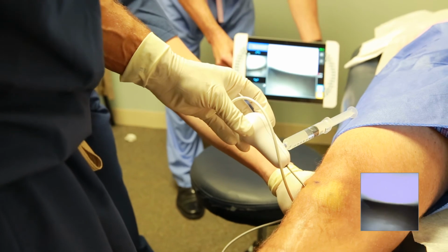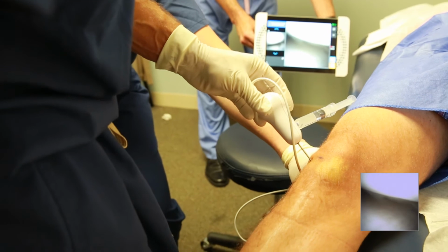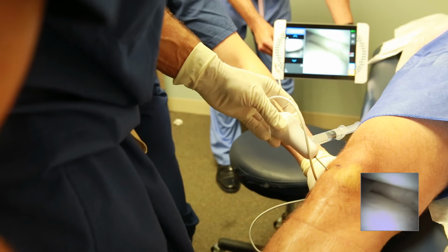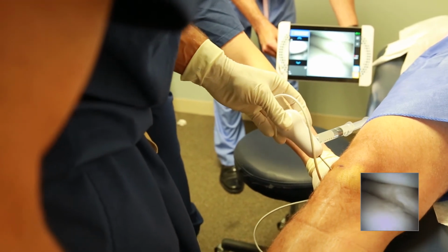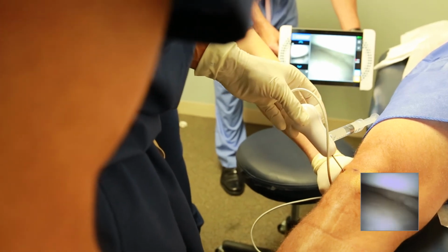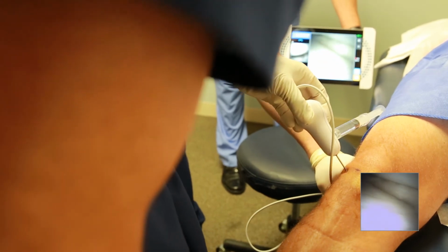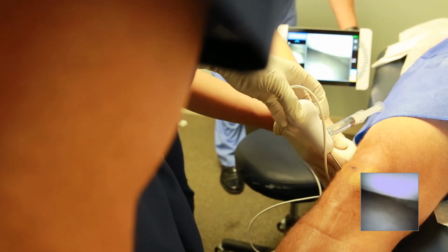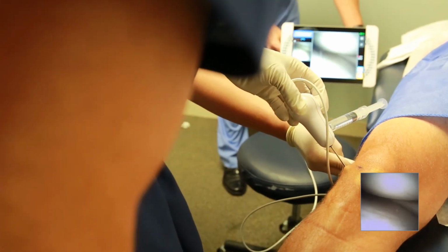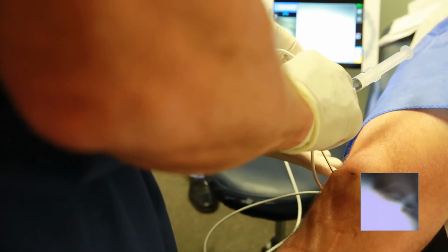Lift that up. Oh, yeah. See, we're in the back. Your medial meniscus actually looks pretty good. It looks like what they did before worked. You have a little bit of meniscal tearing, but medially, you're doing well pain-wise. That's where I think my pain is. On the outside, though. Medial, yeah, mine's, yeah, lateral, sorry. That's correct. So you can see how he looks really good. His medial side looks really, really good, which is surprising.